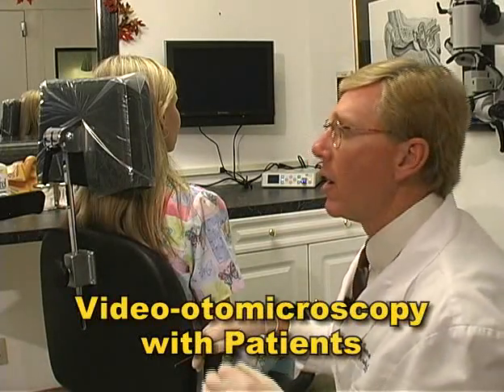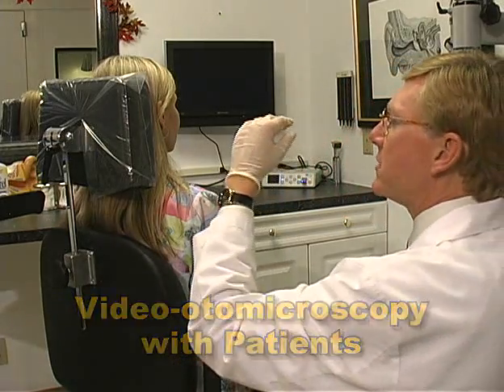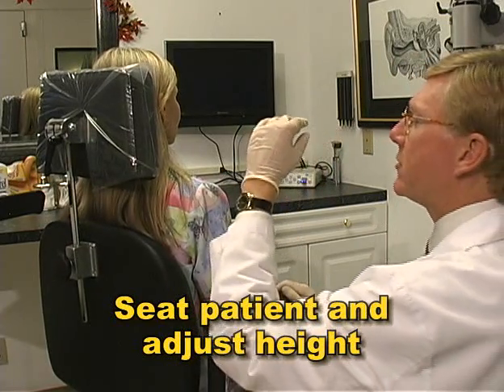The fine focus control is normally used to change your depth of field during a procedure. Here's a demonstration on the basic operation with a patient. With your patient seated, position him or her at a height where you can comfortably view the ear.